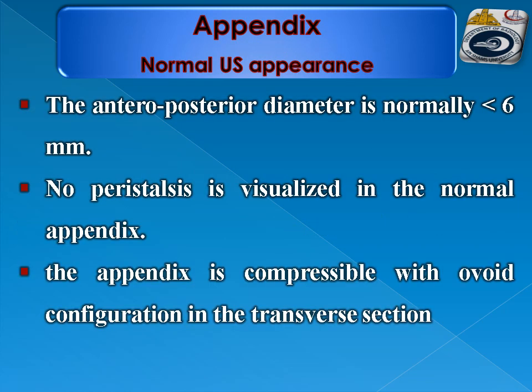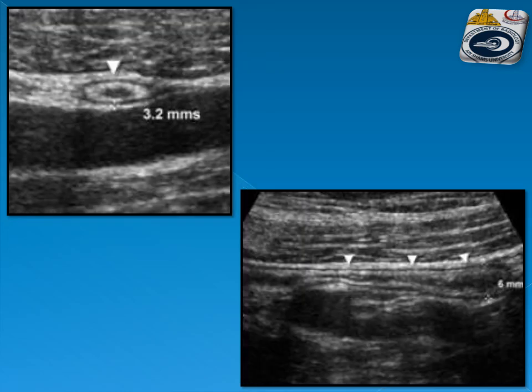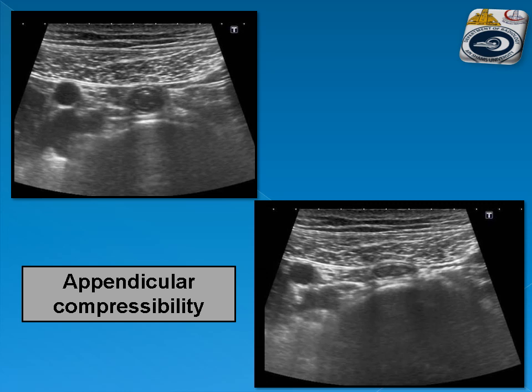The normal ultrasound appearance of the appendix: the outer diameter is normally less than 6 mm. No peristalsis is visualized in the normal appendix. The appendix is compressible with an ovoid configuration in the transverse section with compression. This is an example of a normal appearing appendix in transverse section and longitudinal section — it is rounded, and if compressed, it will be ovoid.